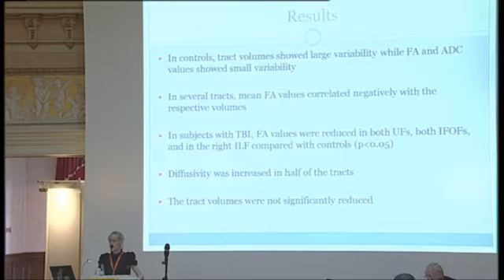Diffusivity was increased in half of the tracts. The tract volumes were not significantly reduced, which may be due to that we had mainly quite mildly injured patients and because in controls also tract volumes showed large variability.